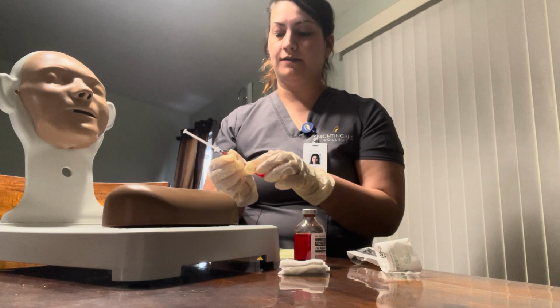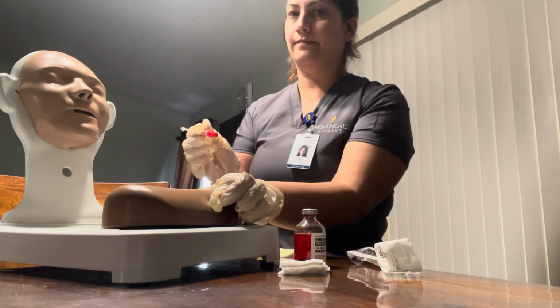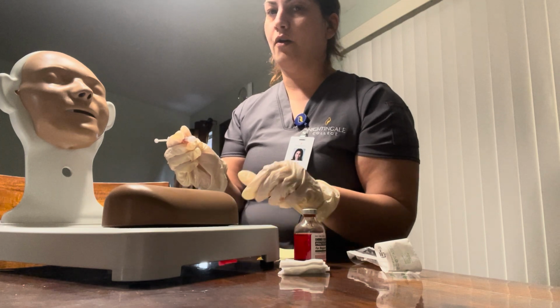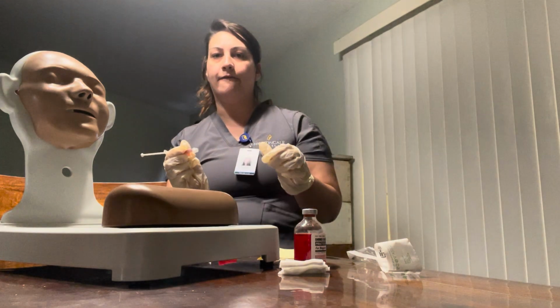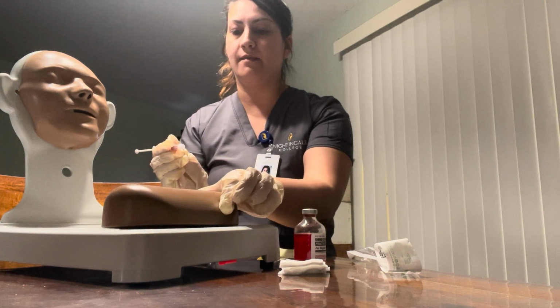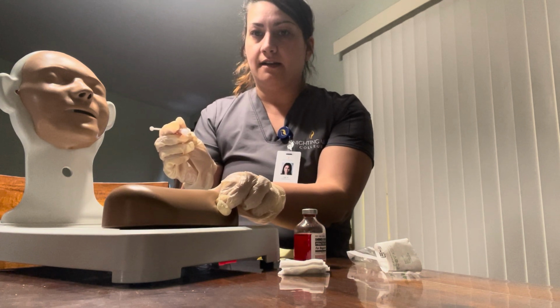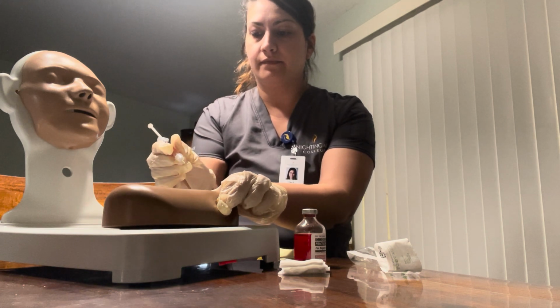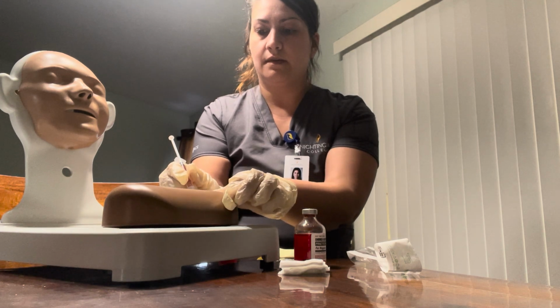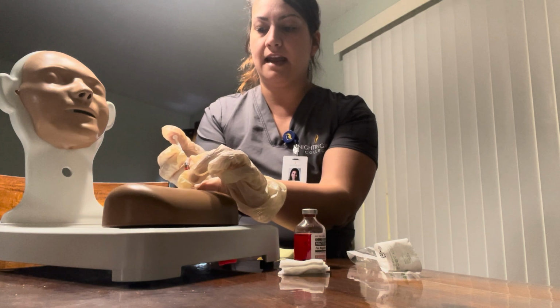We're going to grab our syringe. We're going to grab with the non-dominant hand to take off this. We're going to go at a 45 to 90 degree angle. I'm going to grab with my dominant hand, and we're going to quickly insert it like a dart, palm down. I'll grab it here with my dominant hand. I will push in the medication.